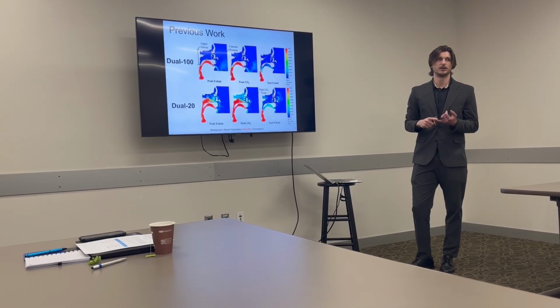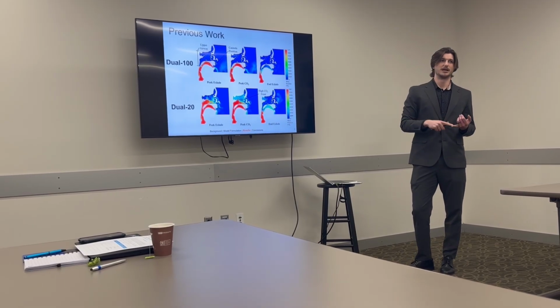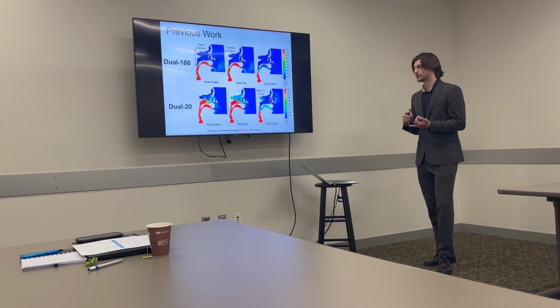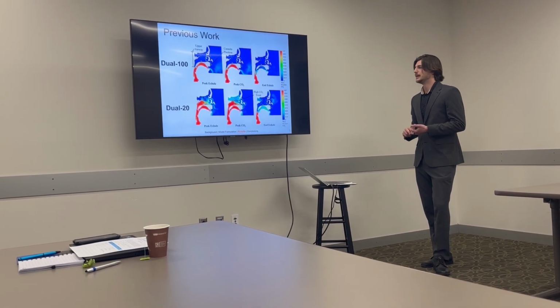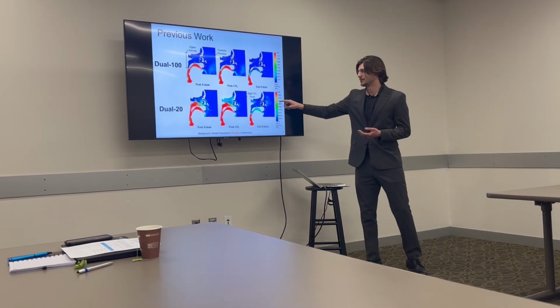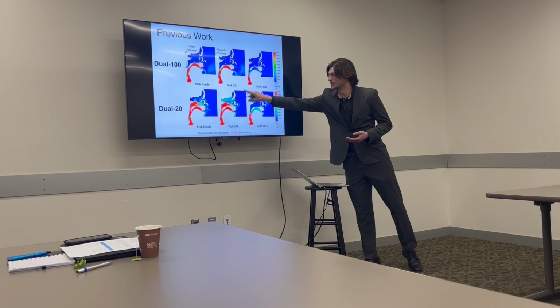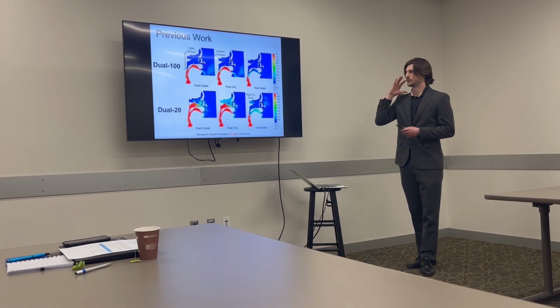We have peak exhale, the moment in the breath cycle at which the patient was exhaling with the maximum expiratory volume flow rate. Peak CO2 is in the middle, the moment in the breath cycle at which the most CO2 was entrained in the airway, and that's not counting the CO2 escaping out into the environment region, so it's just the CO2 in the actual airway.